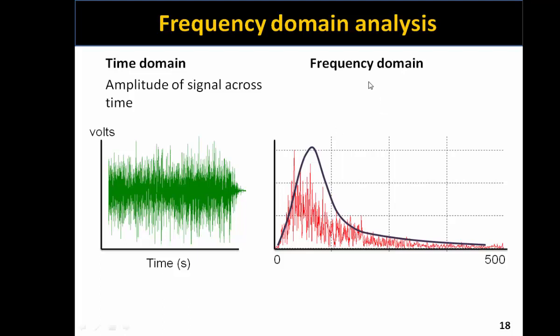If we have an EMG signal expressed in what's called the frequency domain, frequency will be expressed along the x-axis, and the amplitude of the signal will be plotted as a function of the inherent frequency of the signal. If you refer back to the first slide of this recording, you'll see that each motor unit will generate muscle fiber action potentials with very unique frequencies.